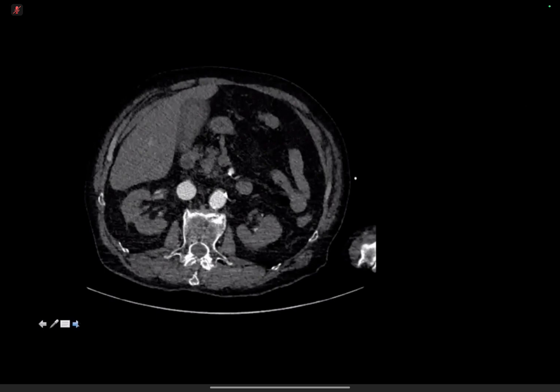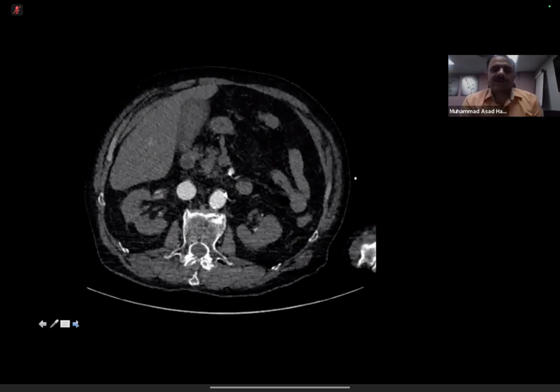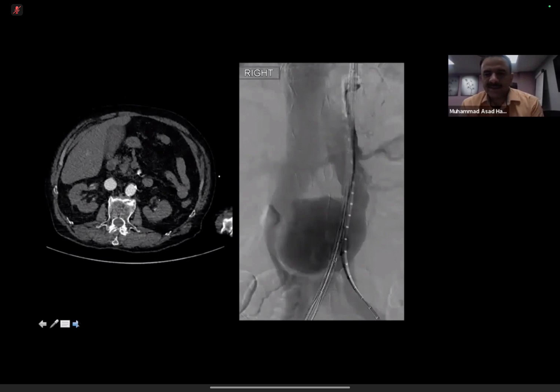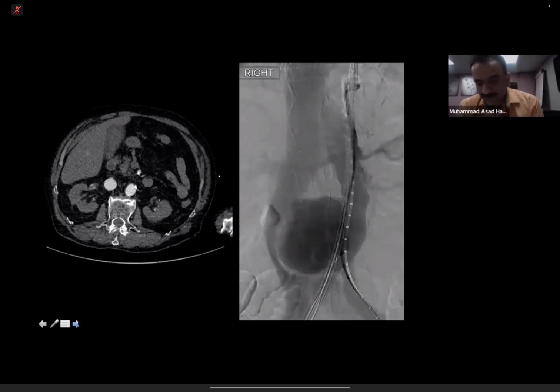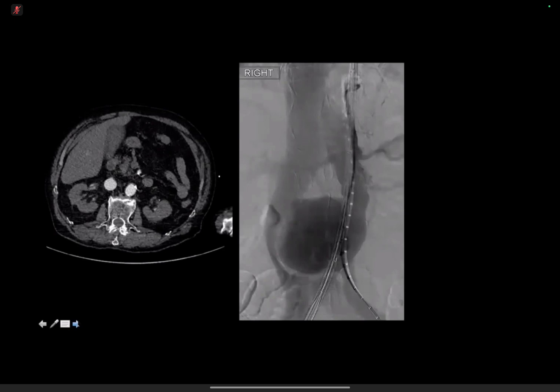Given the similarity in density between the two, I wonder if the patient has an aortocaval fistula. Brilliant. Absolutely brilliant. You have rightly nailed it, that the amount of contrast is the same in the IVC and aorta. So this is an aortocaval fistula. Okay. This is another image just to demonstrate that there is an aortic aneurysm. And as you can see, some of the examiners may show this image, the one on the right of the screen, which is showing a procedure being performed.